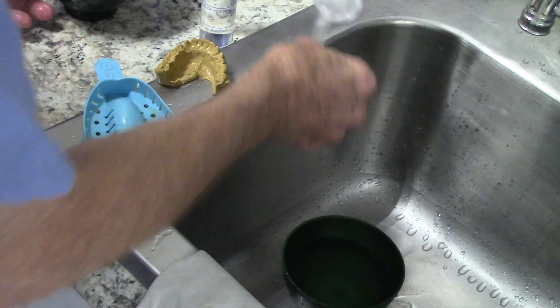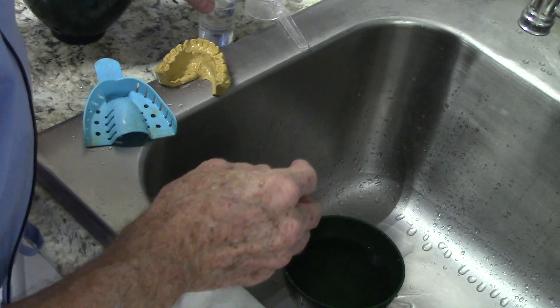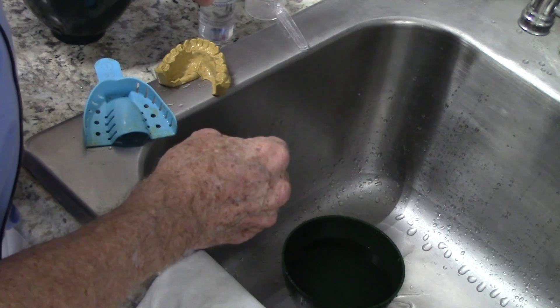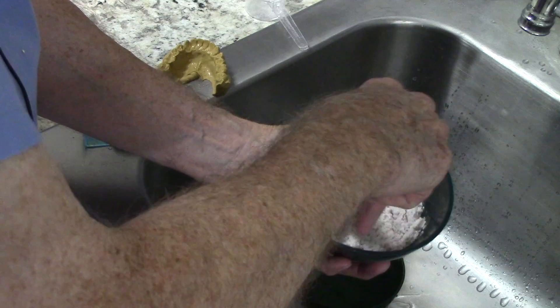I like to use three scoops — I've already got it pre-measured here — and then of course a matching measure of water to go with it. I'm going to go ahead and put the water in and start the spatulation.